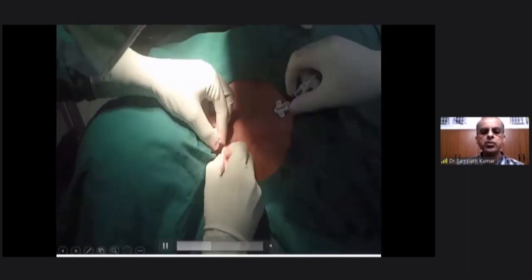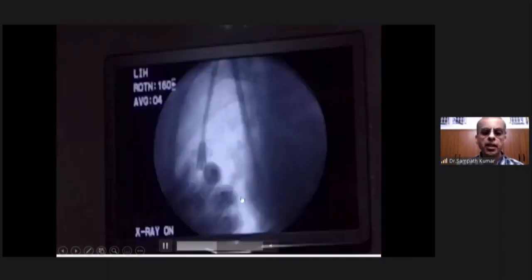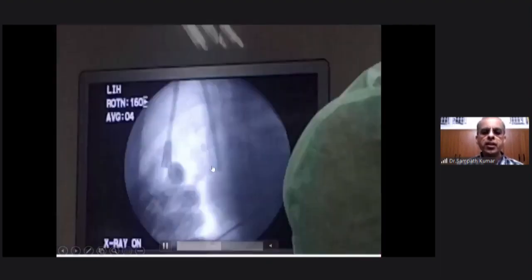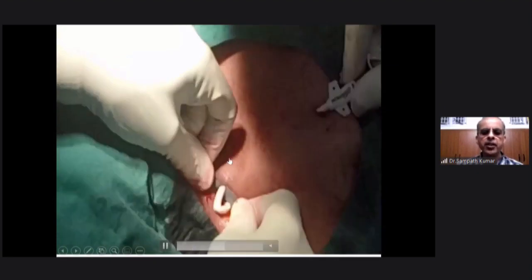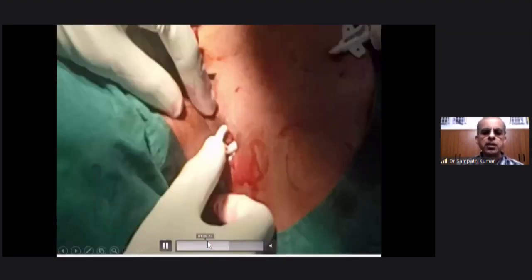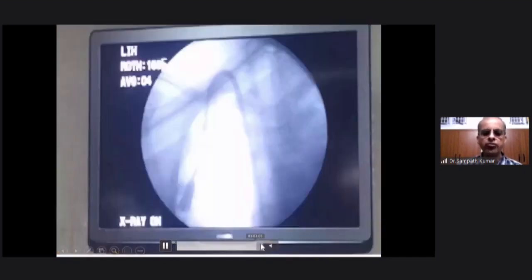You should see to it that you slightly remove the catheter, you remove the external sheath, and then you split it. All the time looking at the fluoro, and see to it that you are at the mid right atrium. So we have made a very small incision. So it is now in the right atrium, and you can give a small tug here to see that there is no kink at the top. So the top is also very nicely placed, there is no kink here, and you see that there is a good flow of blood.